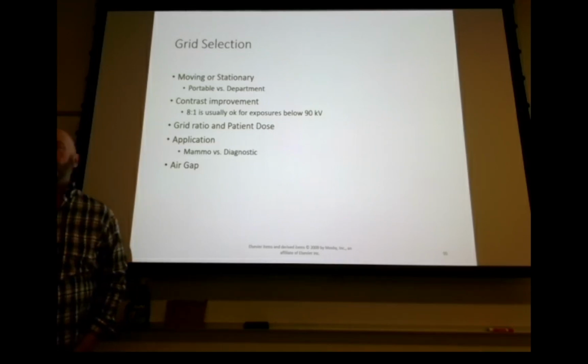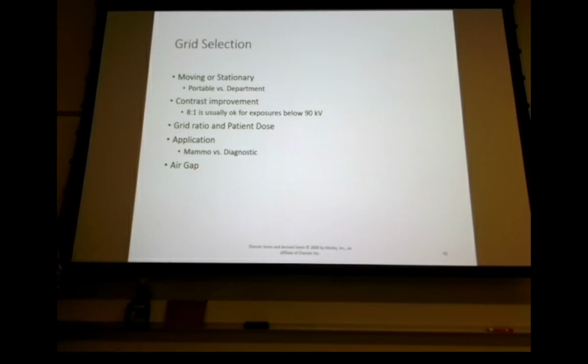What if you have, let's say, a 10-year-old knee that you don't really have a good technique for, so you want a phototimer? Does that 10-year-old necessarily need a grid? My granddaughter, her legs are like this bad. She's tiny. No. So do you need a grid for that? No, you wouldn't want to up the dose. You wouldn't want to increase the dose because it's a kid. You don't need it because you're not at 10 centimeters or above. You could use 65 kVp. You could remove the grid and just shoot directly into the image receptor.